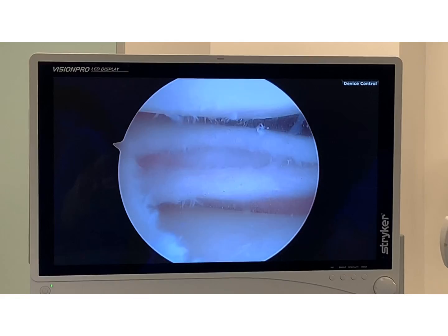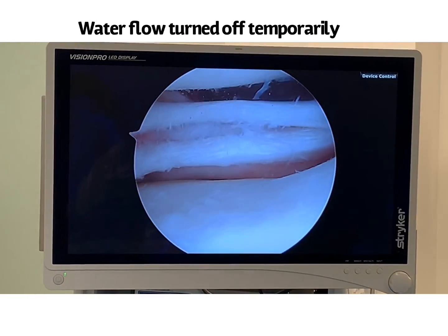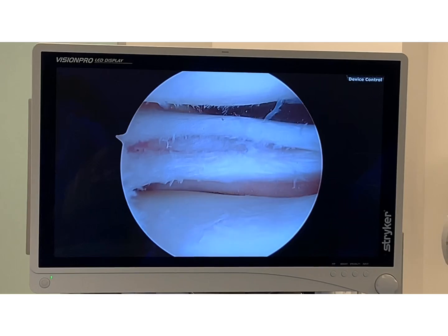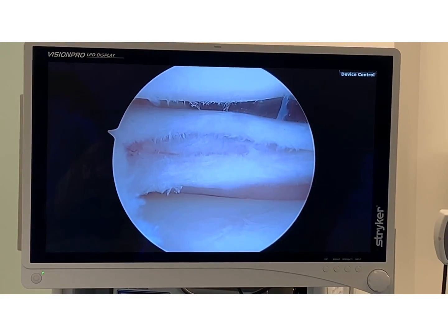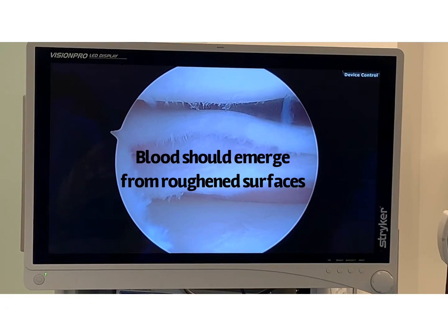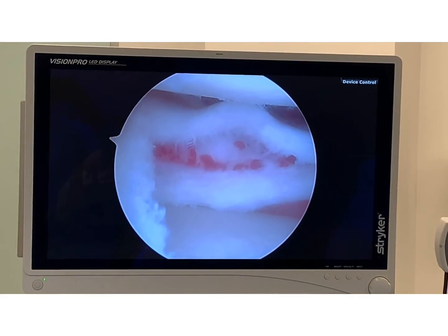There's the gap one more time. What I'm going to do now is shut down the water, turning off the water for a second, and I'm looking to see if we get some bleeding in there. There it is — look at that. That looks awesome.